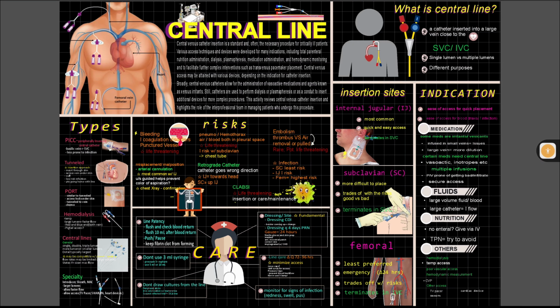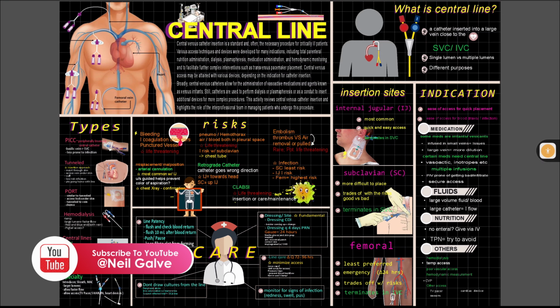Hi everybody, how are you guys doing? Another week of upload and discussion. We are going to start this week with a discussion about your central line. Yes, like you are seeing on your screen, this is all about your central line. You need to know the indications, the insertion sites, the risks, the compliance of care, and the types of your central line. All of that is going to be part of our discussion for today.